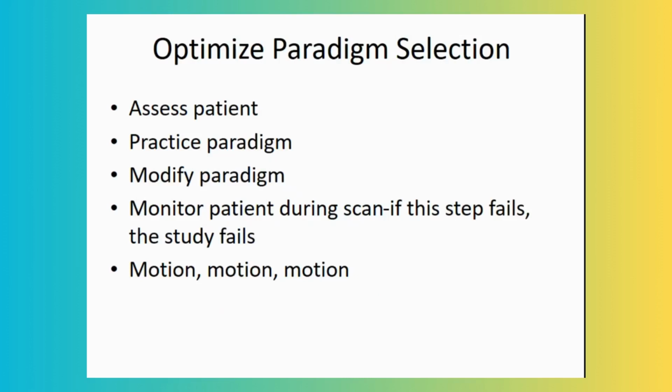We have to optimize our paradigm selection for the patient because patient language barrier and patient education are different. So we have to educate them before going in. The entire scan takes at least more than 1 hour because you have to educate the patient first. These are the paradigms. We will tell you to do this, to do this, to do this. You should not move during the scan. Then the patient will understand, and then the patient will do it inside the scanner. So it's at least 1 hour.